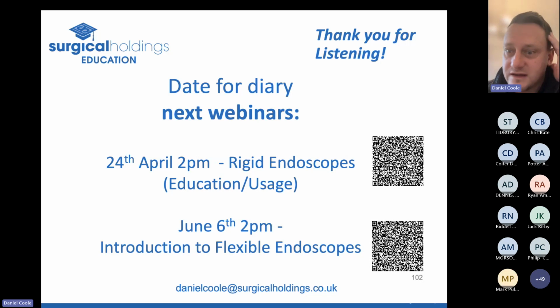So, how widely do services repassivate instruments, and how can we avoid rusting instruments in areas when saline is in contact? I'm just speaking from our perspective in terms of services, and I'm not sure what this might be directly referring to. I'm assuming we mean repair services, but I don't know. I can only speak for ourselves, and that's something that is an extra process that is done. I don't think it's widely done, and obviously to do that you have to have the validated process. So that's the important part.